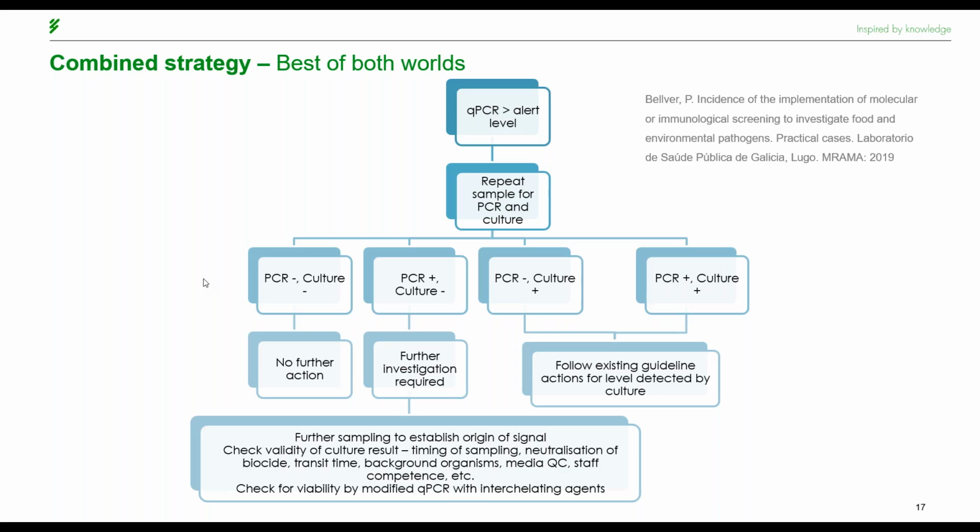And so to summarize, the PCR allows us to do a previous screening and confirmation with the culture is always obligatory. We cannot leave the culture out of our routine. It is mandatory to do so, even if it's just for the confirmation of a positive result obtained.